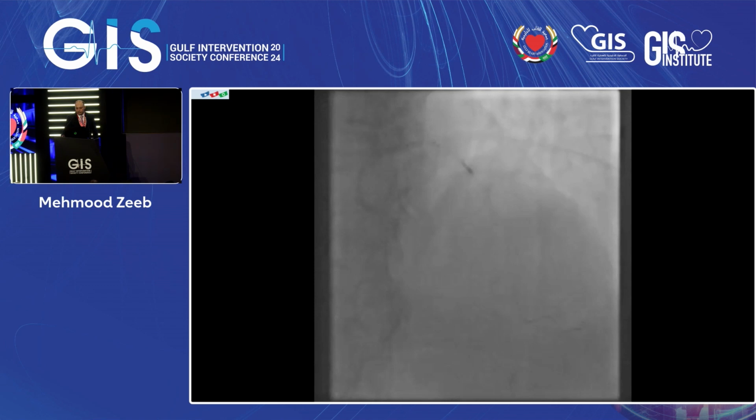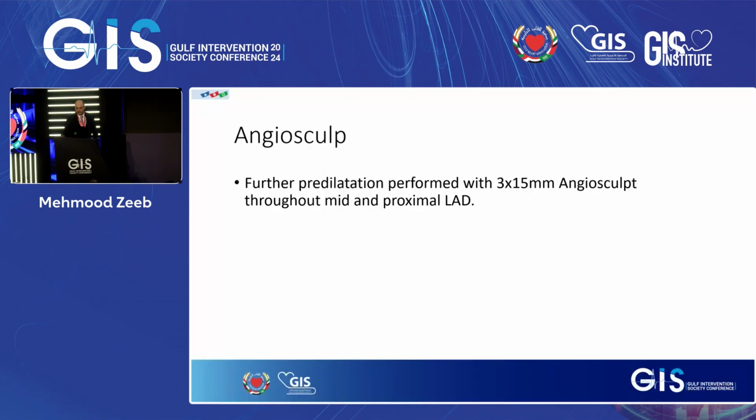Repeat IVUS was performed to make sure the calcification was modified. Further pre-dilatation was performed with a 3 by 15 AngioSculpt balloon throughout the mid and proximal LAD.